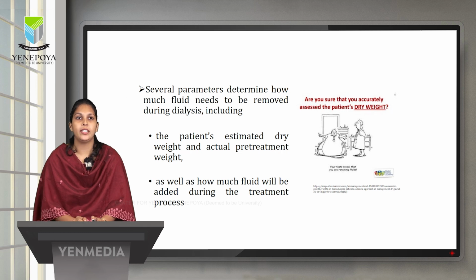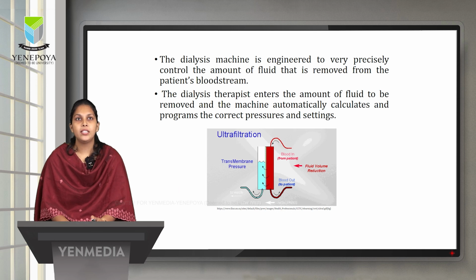How do we set the ultrafiltration rate? The dialysis machine is engineered very precisely to control the amount of fluid removed from the patient's bloodstream.